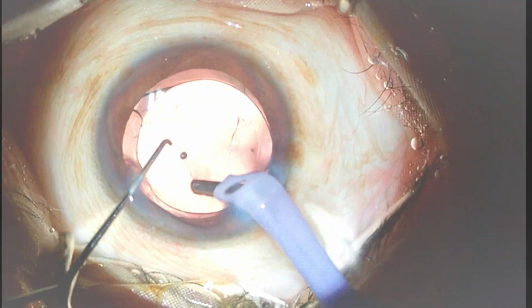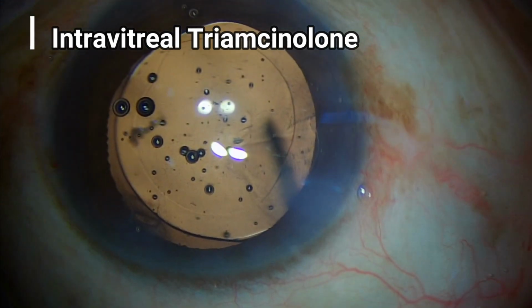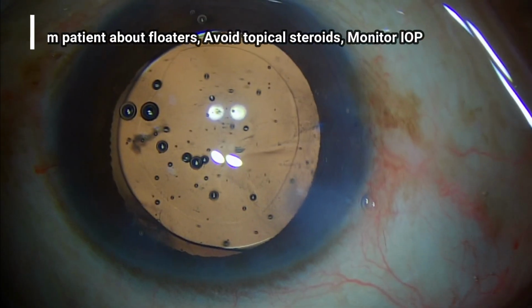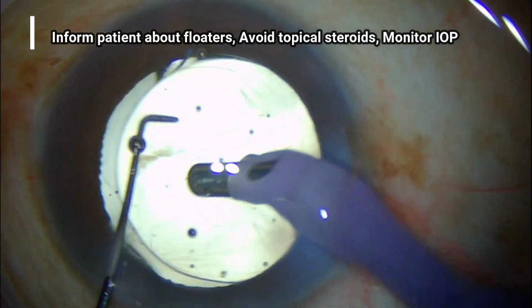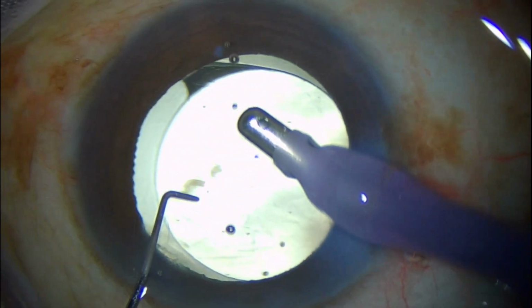Similar way we can also give intravitreal triamcinolone. You can see the needle here and the triamcinolone injection being given, and in these cases you always inform the patient about the floaters which will be persisting afterwards, and avoid giving any topical steroids in this patient because they don't need it.